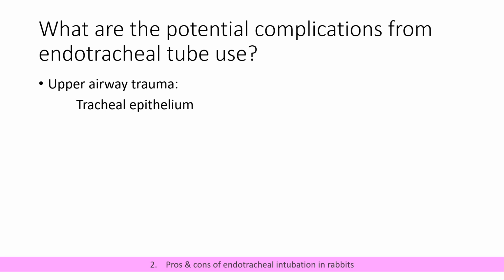Potential complications from endotracheal tube use then. Endotracheal tubes have a place in rabbit anaesthesia. There are times when they are necessary devices, but you should always consider what the complications might be. For me, one of the biggest ones is the trauma to the tracheal epithelium.